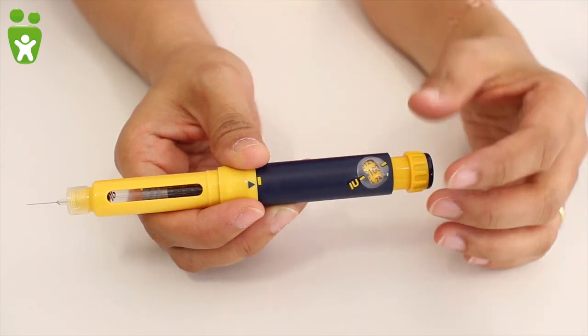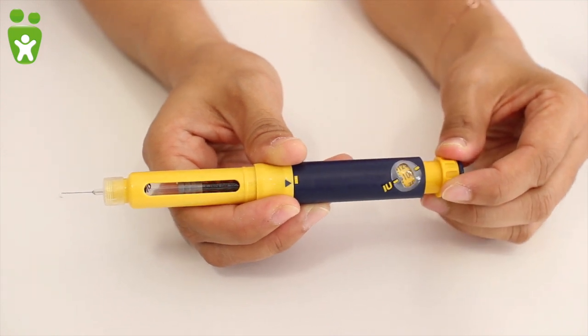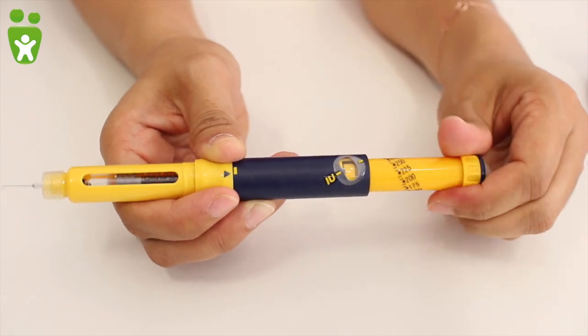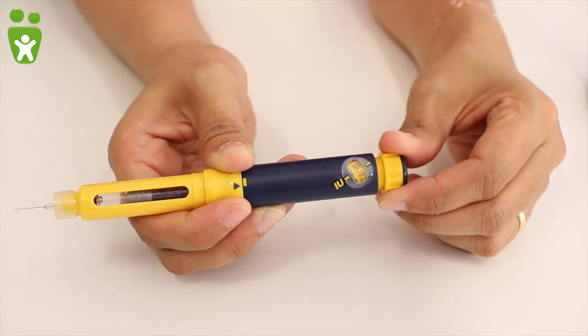If you turn the button too far and thus have too many units, please do not turn the button back, as this would mean you lose part of the medication. Turn the button until it stops and then return it to zero by pressing all the way down. Now you can set the units again.